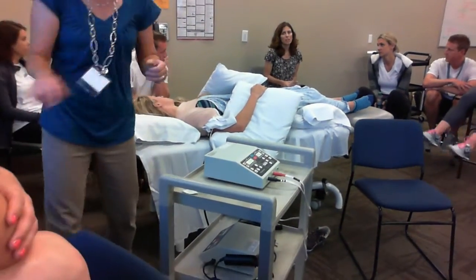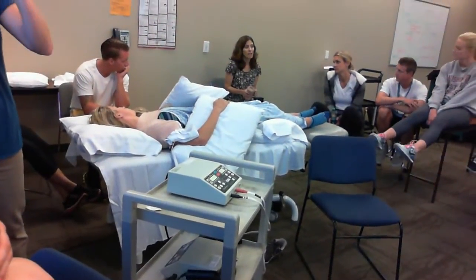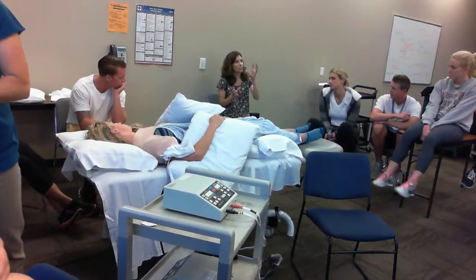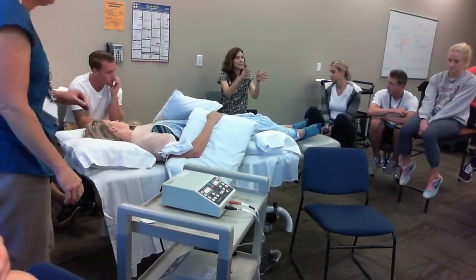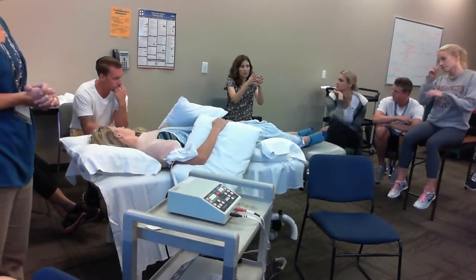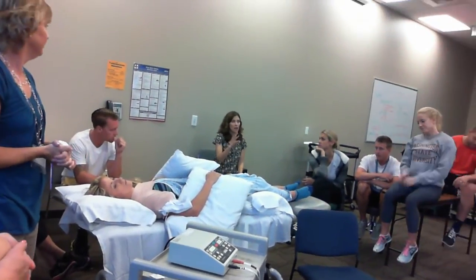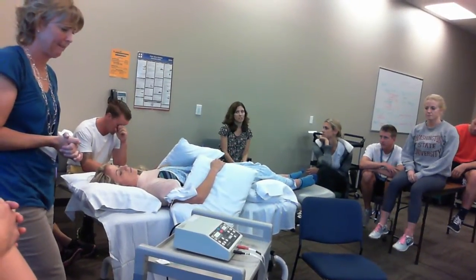And I'm sure you talked about it in lecture, but just to clarify, the pulses per second, that rate, that 80 to 150, during the treatment time, that rate changes. The rate changes throughout the 15 to 20 minute treatment time. You're not picking pulses per second for the treatment, like we did with TENS. With TENS, we picked one rate only. This one has a nice range to it. It varies throughout, which helps to modulate the sensory experience.